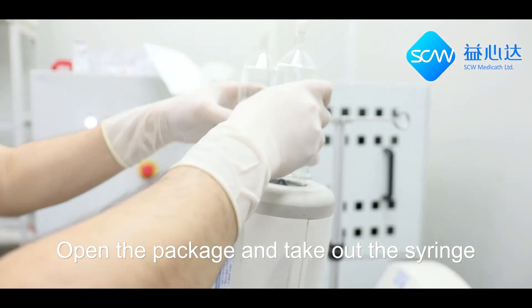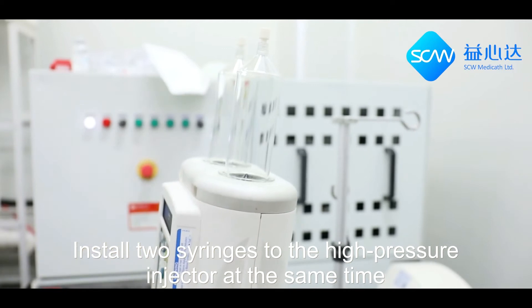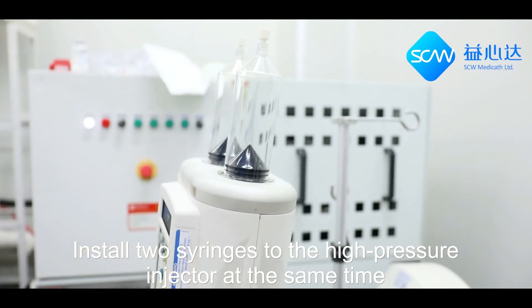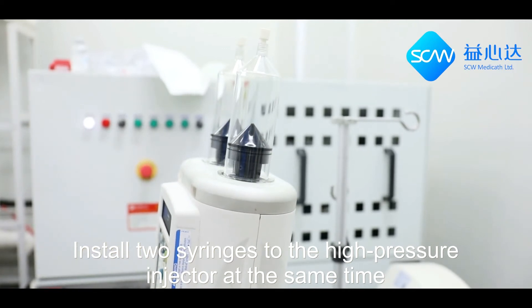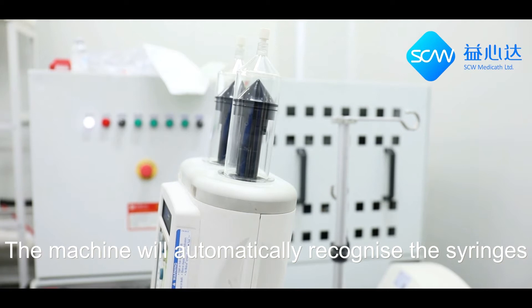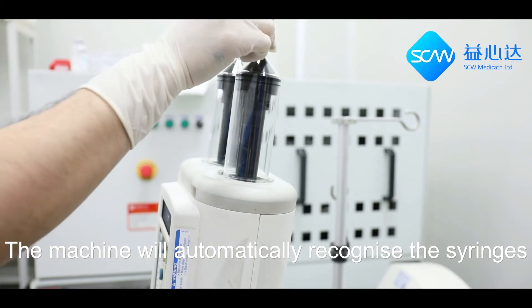Open the package and take out the syringe. Install two syringes into the high-pressure injector at the same time. The machine will automatically recognize the syringes.